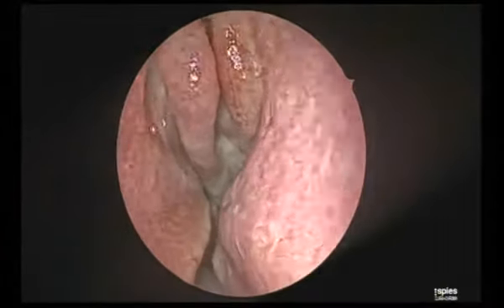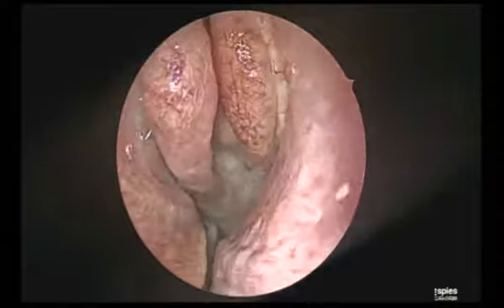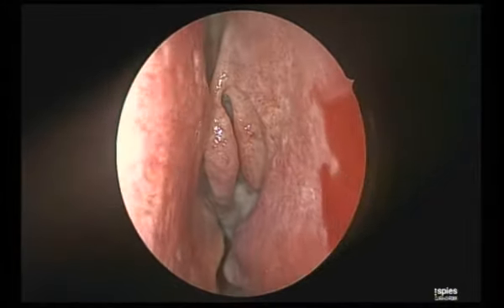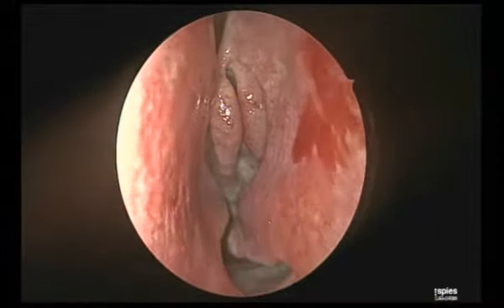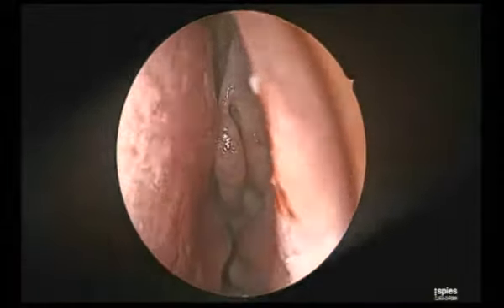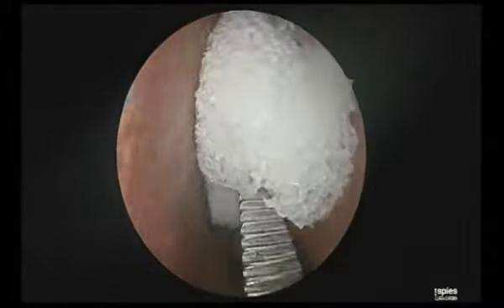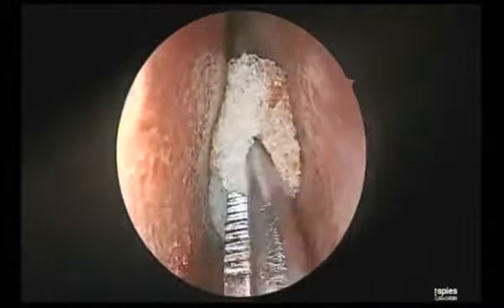So this is all about the preparation. Now I'll skip the pre-operative part because of the time. What I am going to emphasize, that is very, very important, is the intraoperative preparation. To me, there are two important things. One is the topical decongestion, like what I am using, this merocell soaked in the solution of 1 portion adrenaline and 4 portion saline.